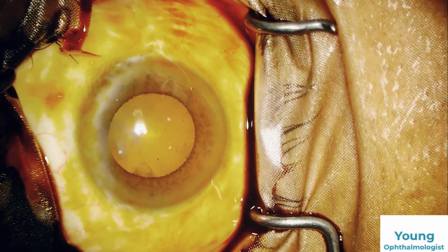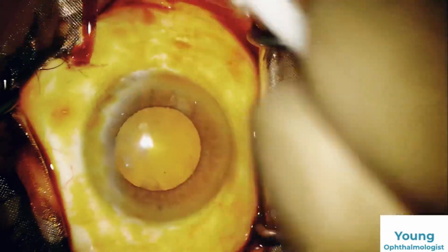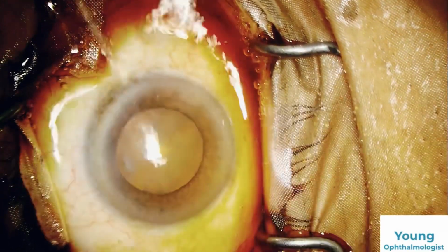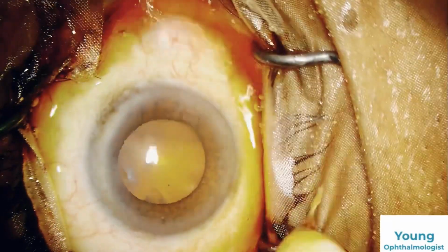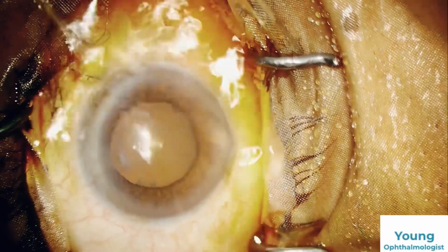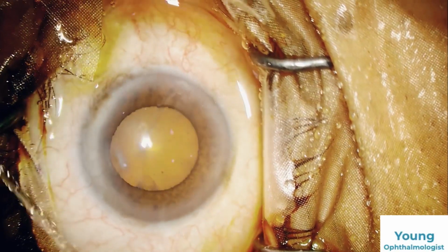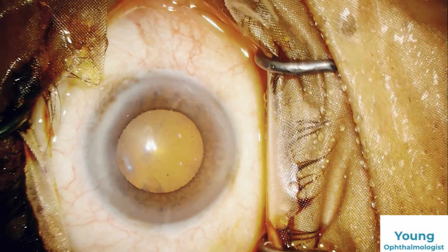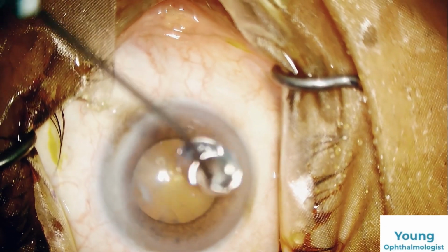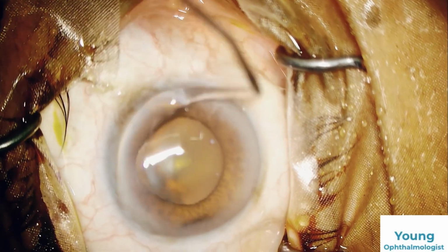I always instill 5% betadine to wash the conjunctival sac. Outside the OR in the shifting room, we put betadine for a contact time of 2 to 3 minutes. Here again we put betadine to wash out the meibomian secretions or any dust particles. So it helps to clear the cornea and the sac area. I always put visco over the cornea to have a clear view.